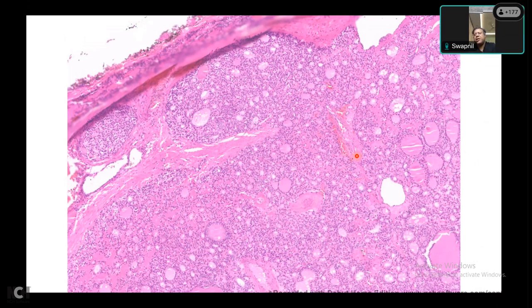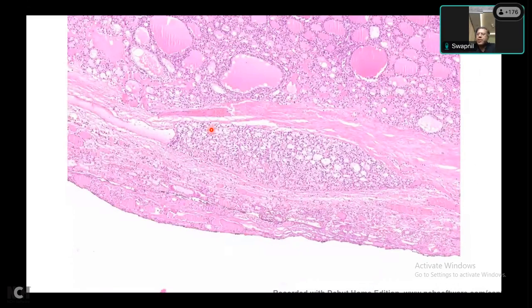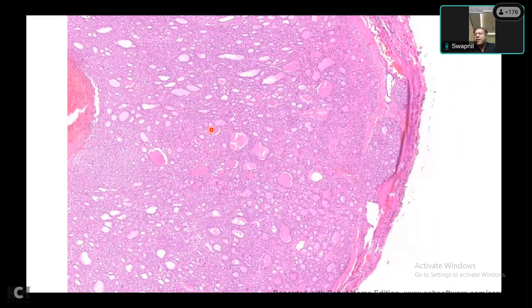Start at low magnification. The cellularity tells me it's neoplastic. At low magnification, I can locate the capsule and see whether it is complete or incomplete. And if I see a complete capsule, I am now looking for capsular invasion, again at low or intermediate magnification. Only then do I jump into 40x, and it's only to look at papillary nuclear features, anaplastic features, as in nuclear anaplasia, not the architectural anaplasia, and mitotic figures, to rule out high-grade differentiated thyroid carcinomas or some other lesion like that. So, this is my general approach to this kind of a case.